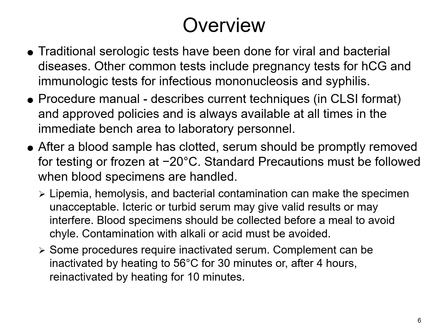Some procedures may require the use of inactivated serum. Inactivation is a process that will destroy the complement activity. Complement is known to interfere with the reactions of certain syphilis tests. Complement components can agglutinate the latex particles used within the testing and cause false positive reactions due to the visualization of that agglutination. Complement may also cause lysis of indicator cells in hemagglutination type assays.